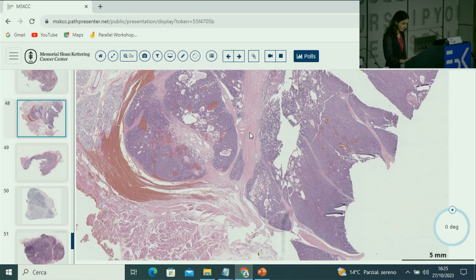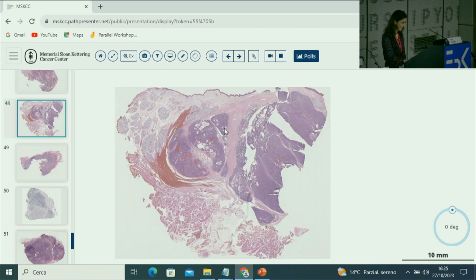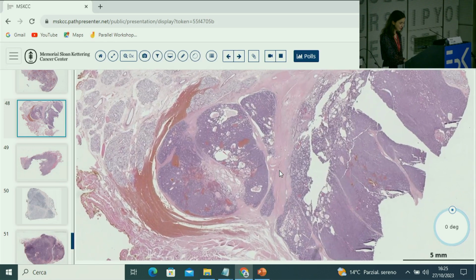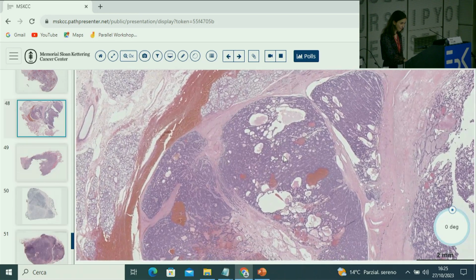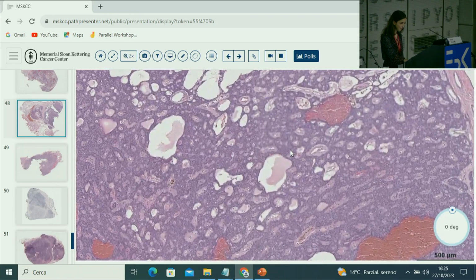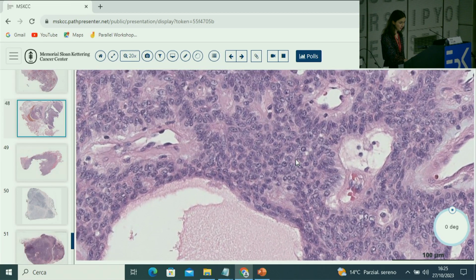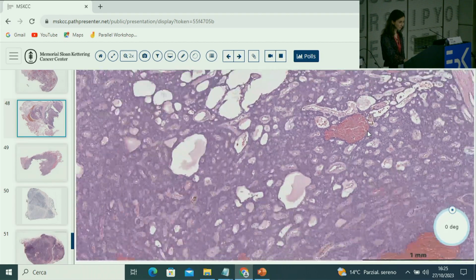What do you think of this case? Cancer, yeah. Yeah, that's very important. It's in the palate. It has this lobular, nodular growth pattern that is invasive, as we said in salivary gland. It has a cribriform pattern, right? Let's go on high power view. Actually, I showed you a picture of this case.